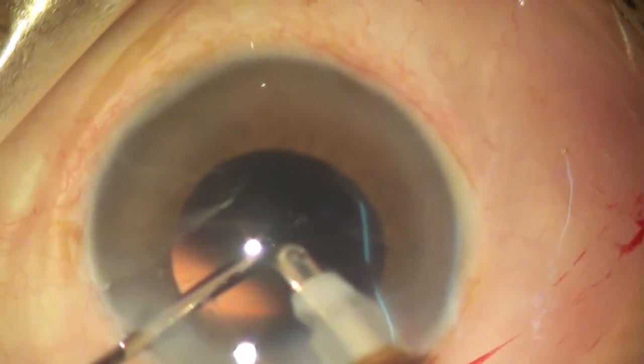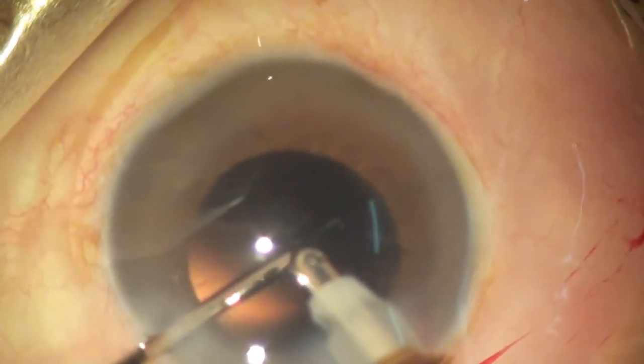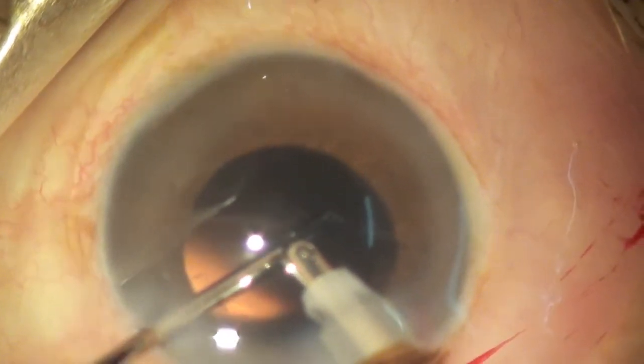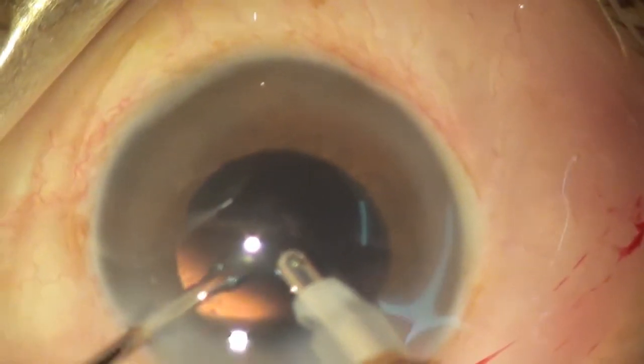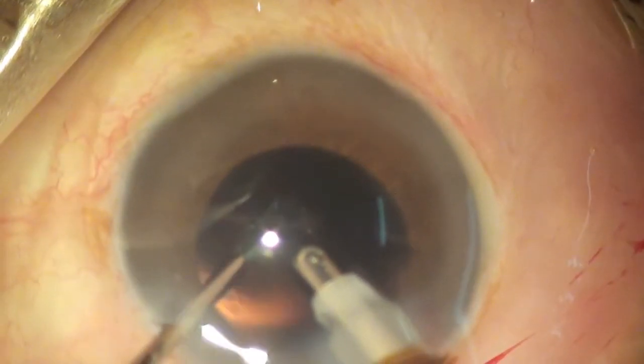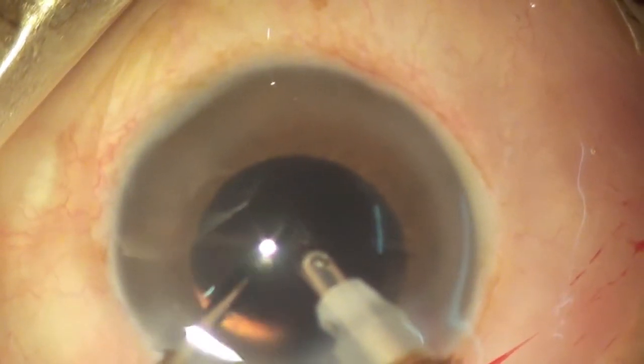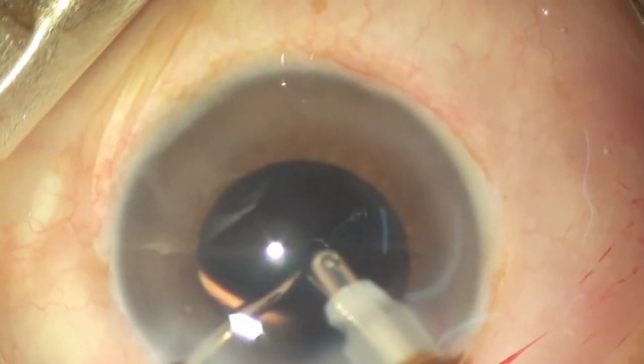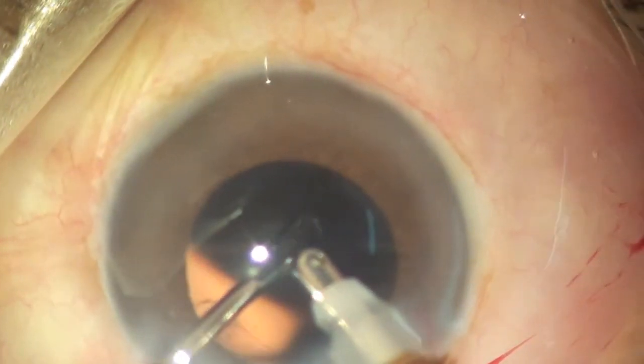The third tip is: please create a convenient side port to enter the eye. If this side port was not convenient, I would have used the 1mm stab knife to make a new entry and go into the anterior chamber through a convenient side port. Now I am trying to grasp the PCC flap that is floating about in the anterior chamber.